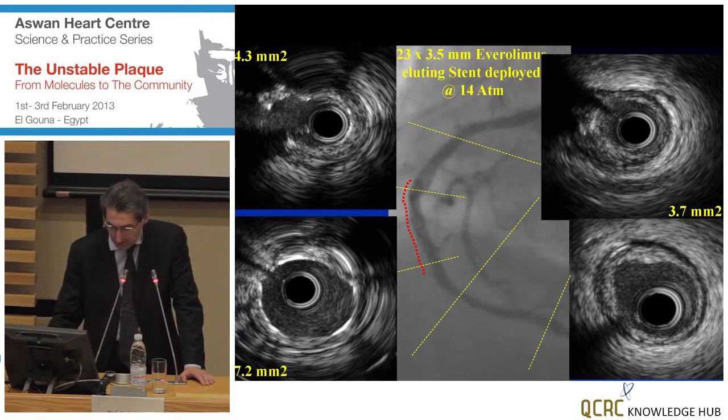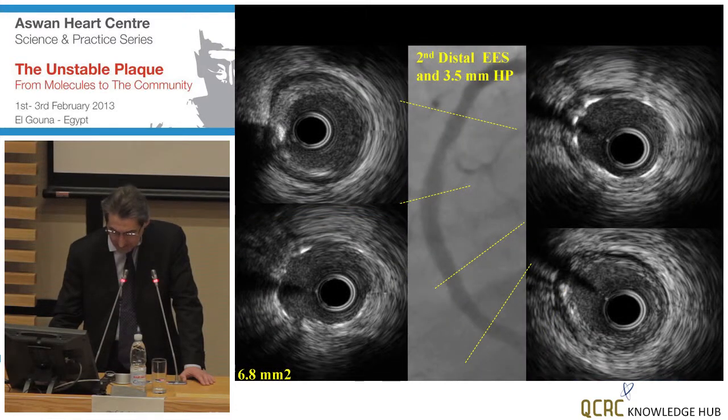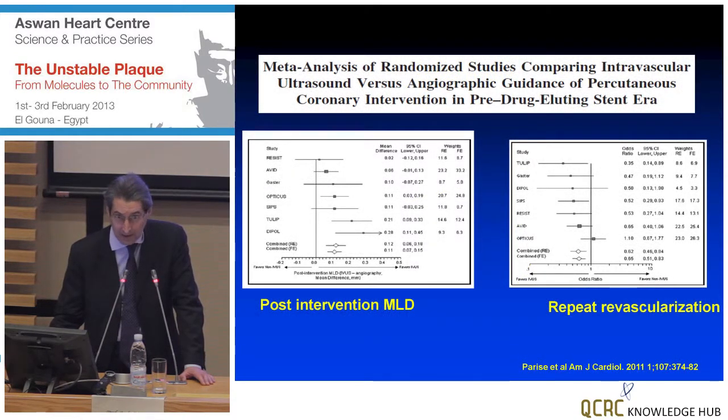Not only that, if you consider this area, you have a fairly large plaque burden and a small area, and having this at the edge of a stent is probably not a good idea. Definitely you can find areas downstream in the vessel which look more normal. So an additional stent here, nicely expanded at high pressure, 24 atmospheres, with a short 3.5 balloon, makes a complete difference in the image, with this nice, regular, uniform lumen. And it's hard to believe that this will not translate into clinical differences in outcome.